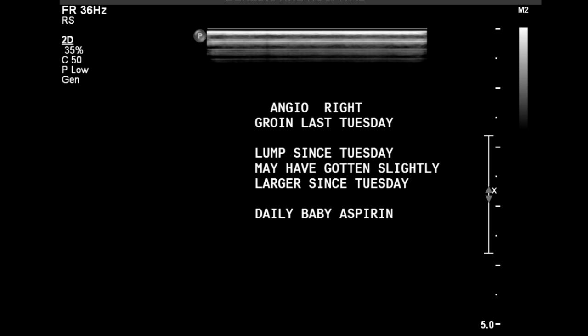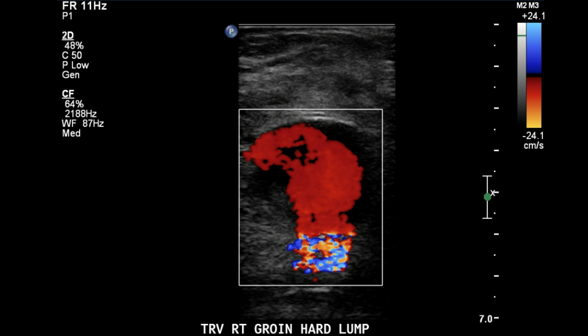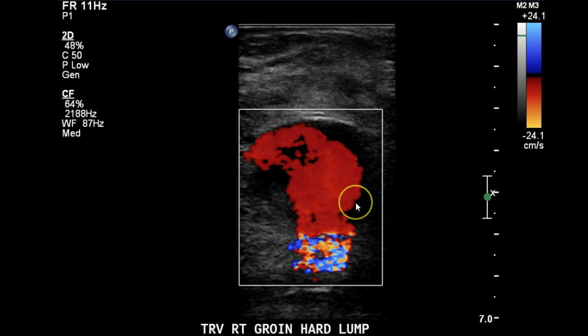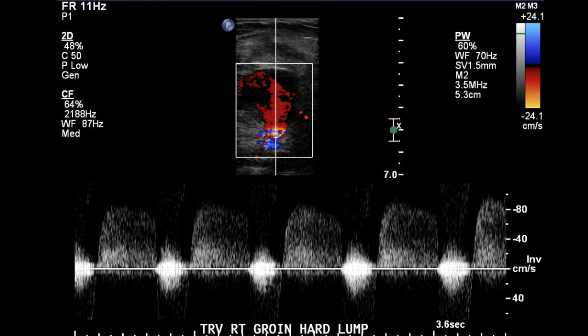Once you see the next image, your suspicions are confirmed. You see the aliasing here, and color flow moving into a large hematoma-like structure. When we put our Doppler in the area of aliasing, you see the classic to-fro pattern of the pseudoaneurysm. This flow simply represents flow into and out of the PSA.